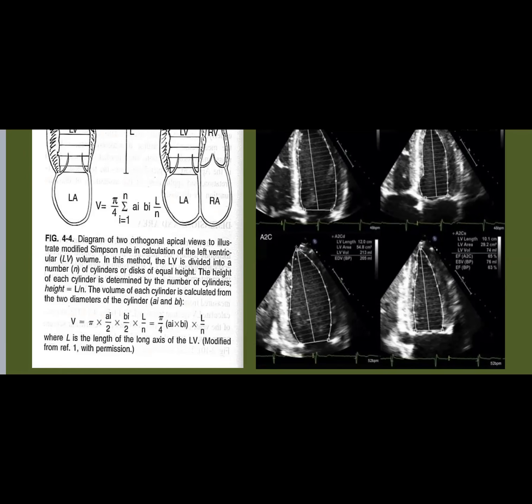If I'm talking about an ejection fraction of 60 or 55 or even 50 in a normal asymptomatic patient, I don't bother. But in a chemotherapy patient, or in severe MR, when the ejection fraction of 50 is so different from 60, it marks who will and who will not go for surgery. I have to be precise even to 5%.